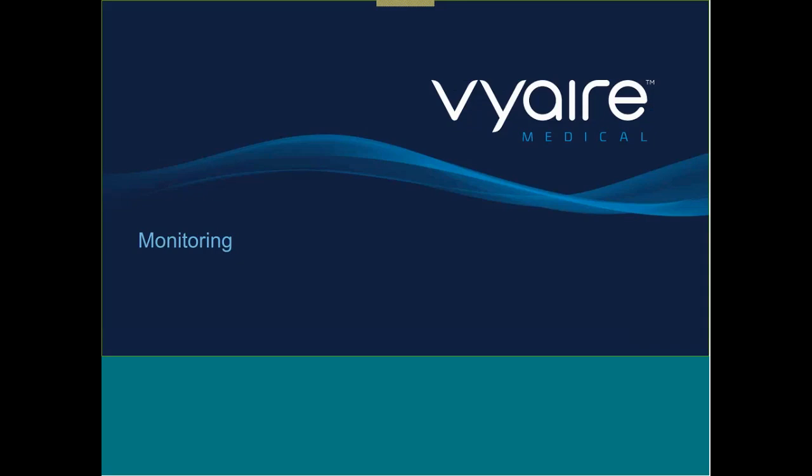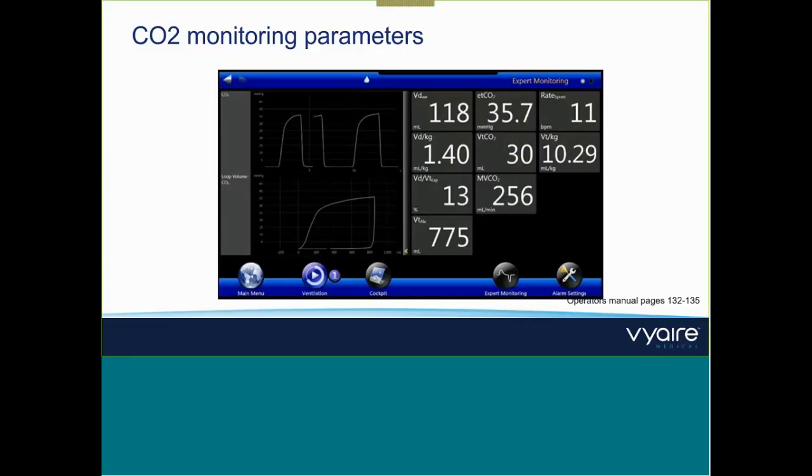Next part, monitoring. When you're looking at Bellavista, we have lots of values, which here are mainly coming from the volumetric capnography, and we will talk about this in part 2 as well. I just want to go through them. The explanation for these values will also be in the second part. The first one, from the volumetric capnography, is the airway dead space. Then we have the dead space per kilogram, the ratio of dead space and tidal volume, and the alveolar tidal volume.